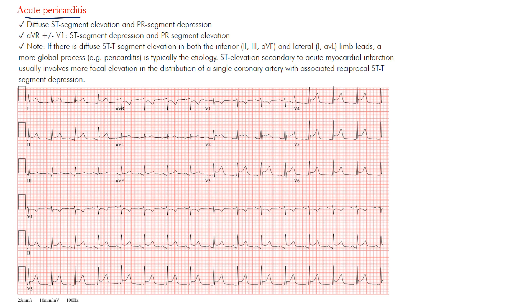In this EKG you can see that the ST segments are elevated — this one here is slightly elevated in V2, V3, V4, V5, and V6. So essentially diffuse, meaning widespread ST elevation in the majority of leads — not so much in lead three here, but you can often see it in that one as well.